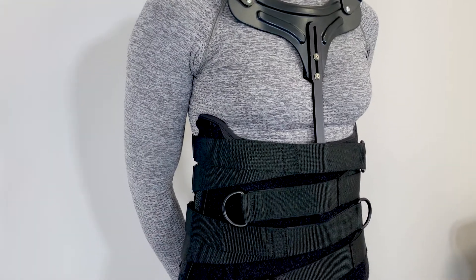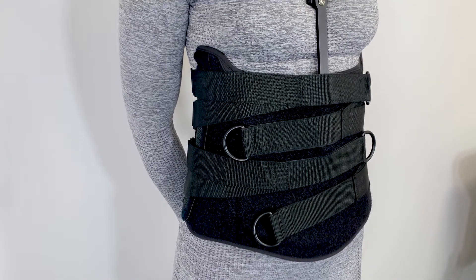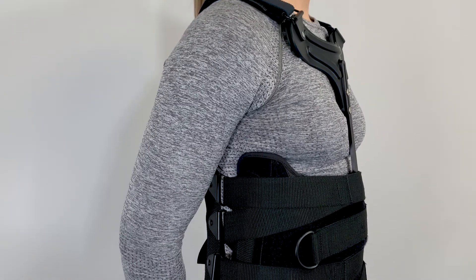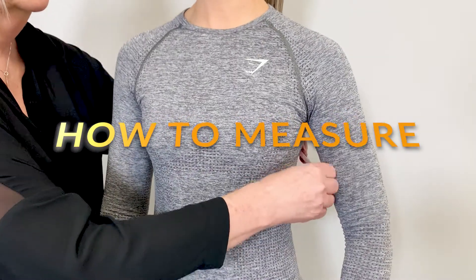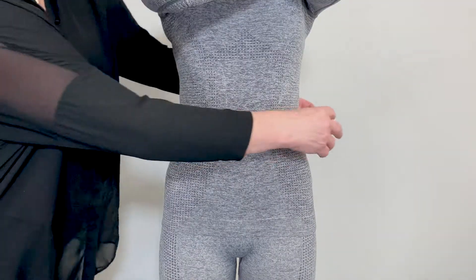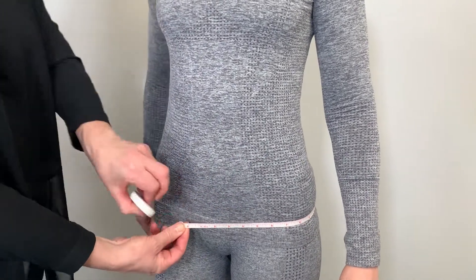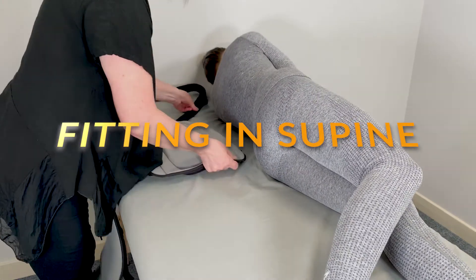The California Soft Spinal System is a complete modular management system offering effective treatment for a variety of spinal clinical indications. The interchangeable system is lightweight and completely adjustable, available in LSO or TLSO designs. It can be sized with three simple measurements: chest, waist, and hip circumference. The modular spinal system can be shipped with an anterior thoracic extension and posterior thoracic extension dependent on clinical requirements.